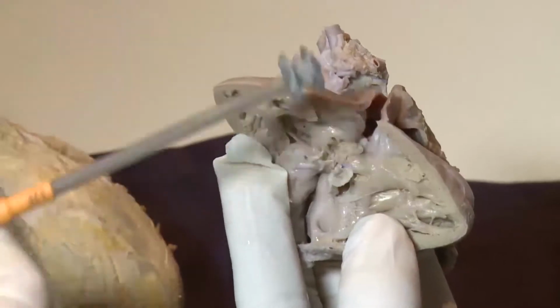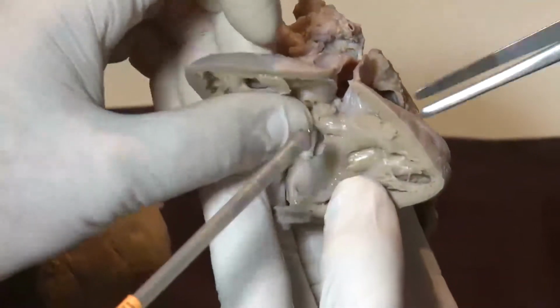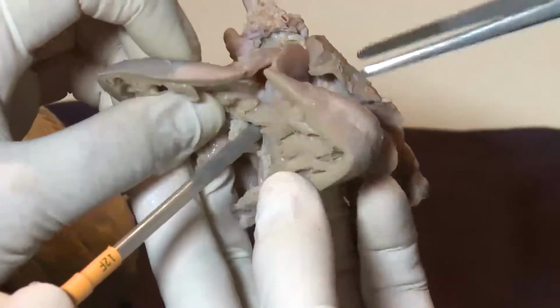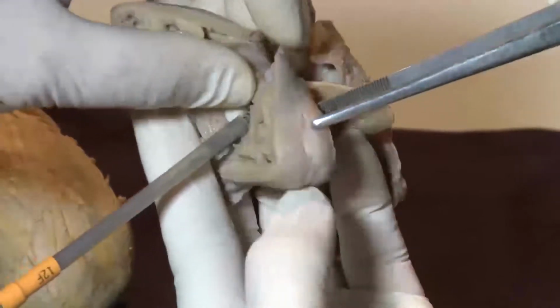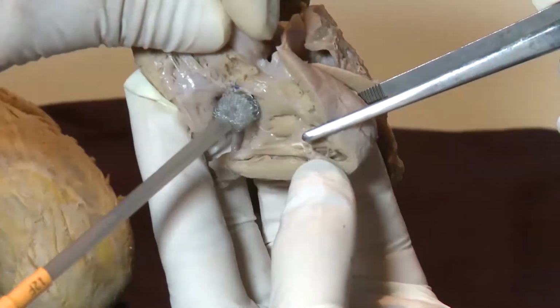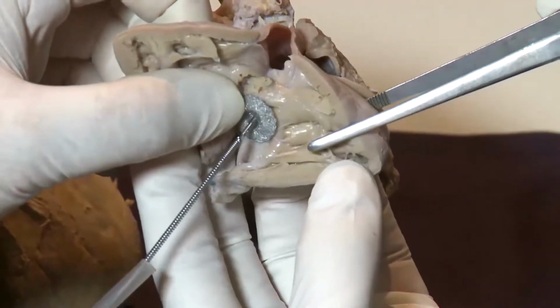So I insert it and open it on both sides. Okay. The size is not well matched. It's a little bit bigger device.